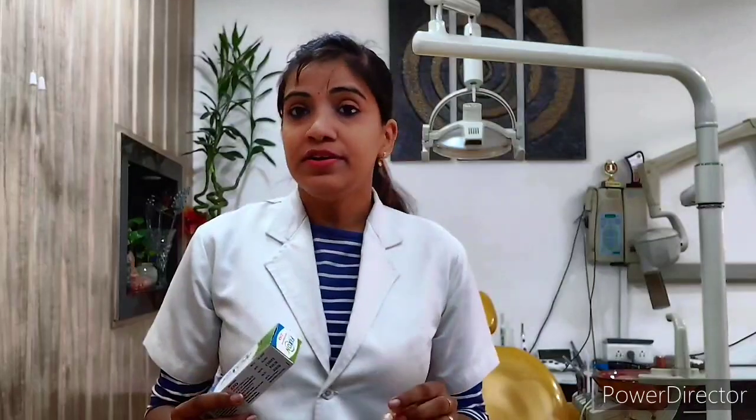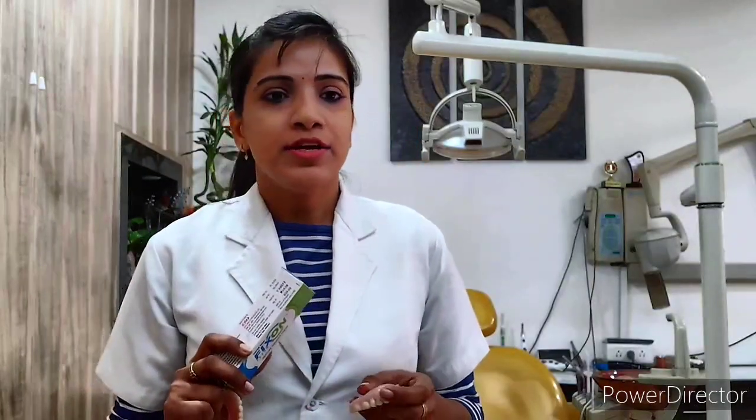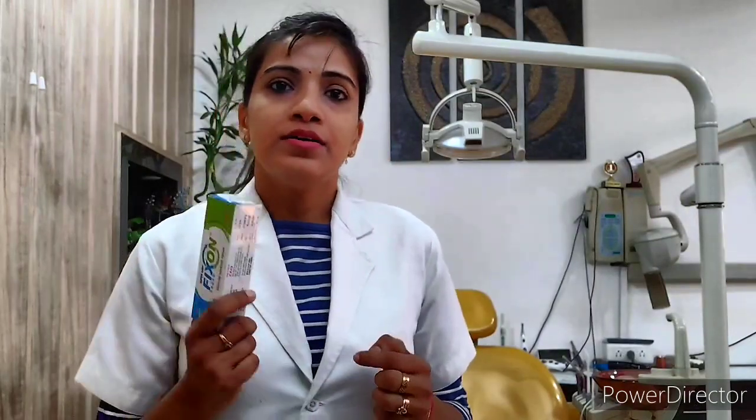We will not use too much because if it goes into the stomach it can cause gastritis. We will also not use denture adhesive in partially edentulous patients because it is acidic, and when it is acidic around natural teeth it can cause a lot of decay.